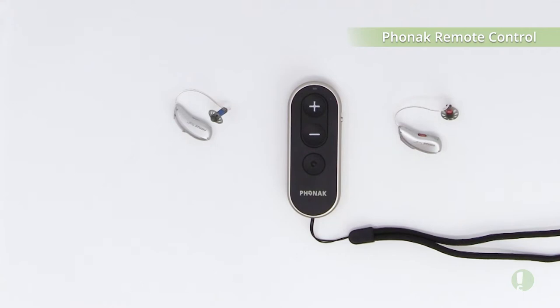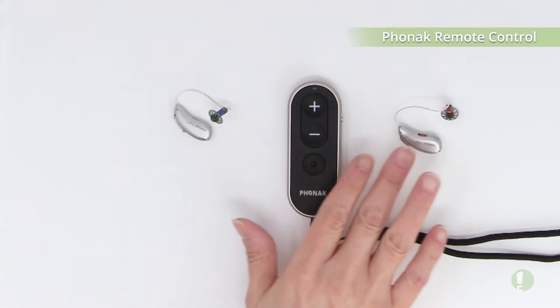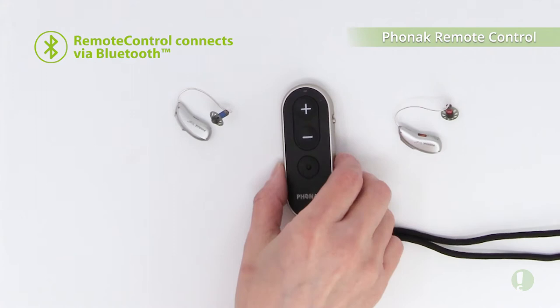Before you can begin using the remote control with all Marvel hearing aids, you first need to pair the remote control to the Marvel hearing aids. You want to make sure your Marvel hearing aids are on and then there are a few steps that you need to take with the remote control.